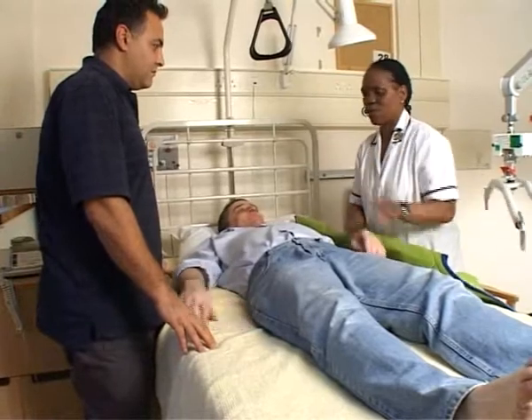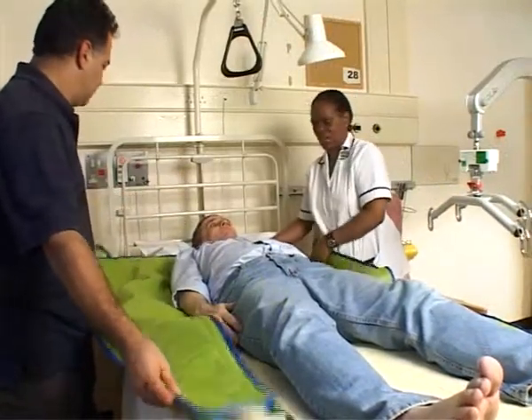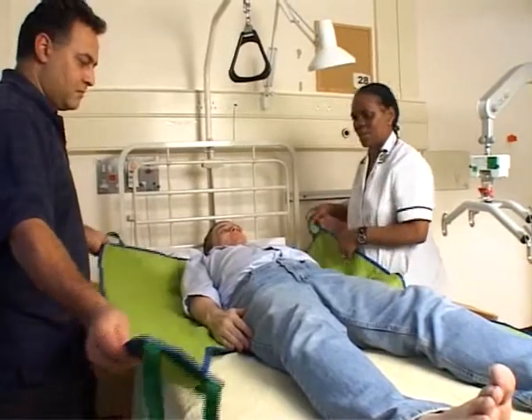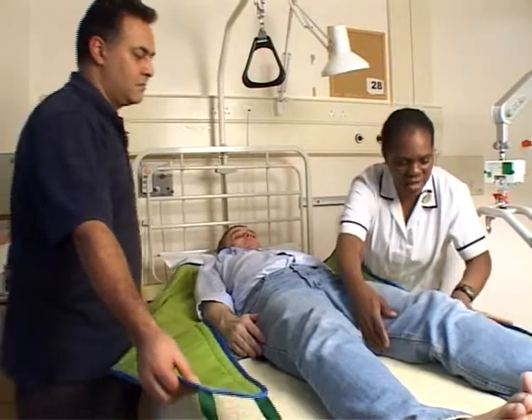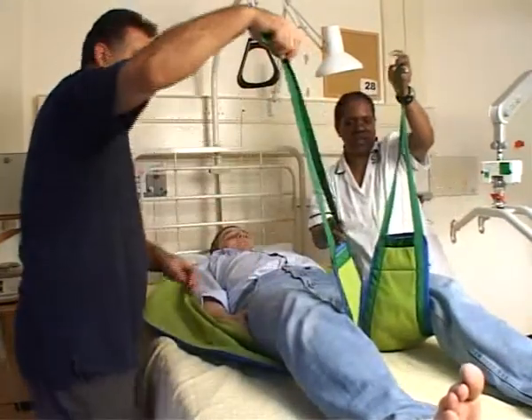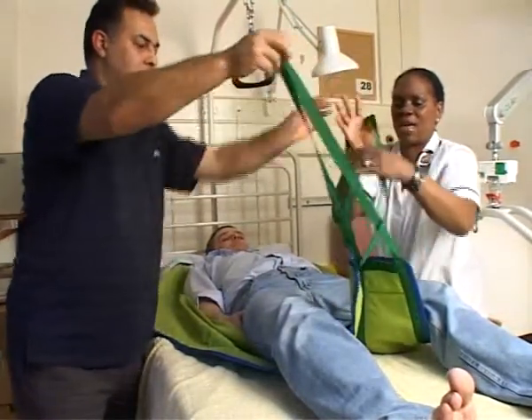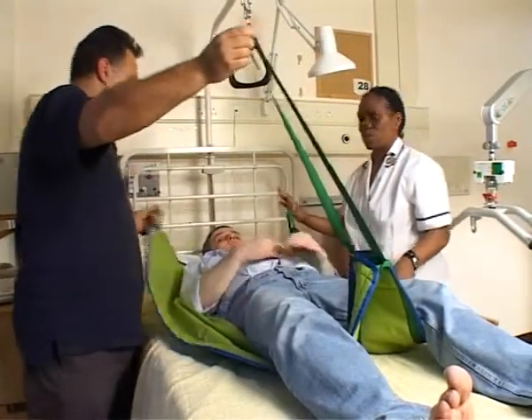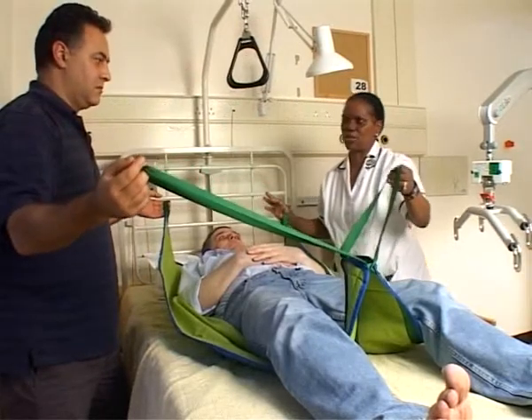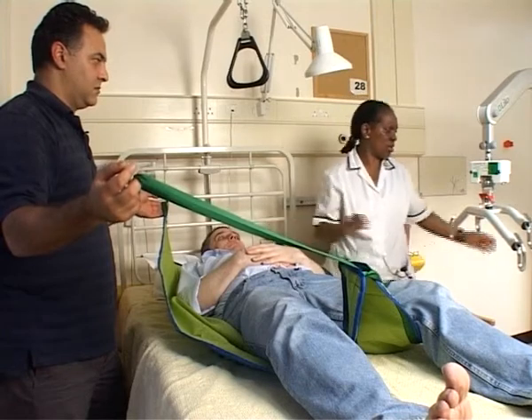Ed, if you roll over towards your right side, and then roll back. We just have to check that he's actually supported on both sides. The next bit is actually putting the bottom sling under. Make sure you've got the sling there, and then we're going to cross them over. Just hold on to the top — the top doesn't cross over, it's just the bottom bit that crosses over. And then we're ready for our hoist, to hoist him out into the chair.